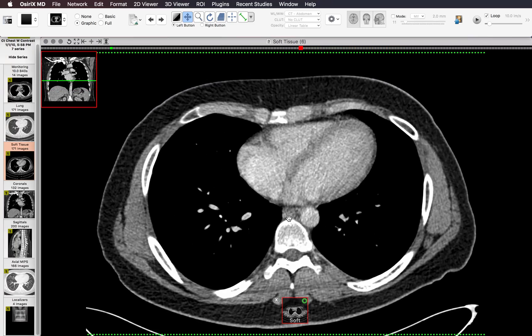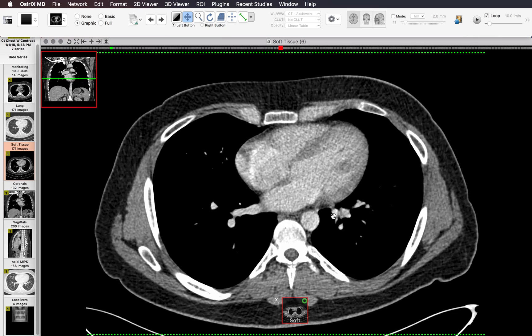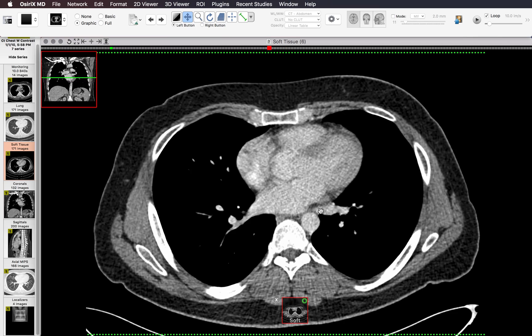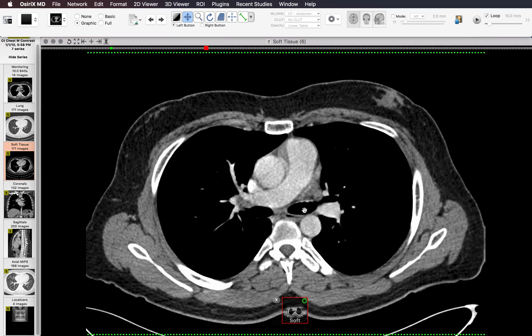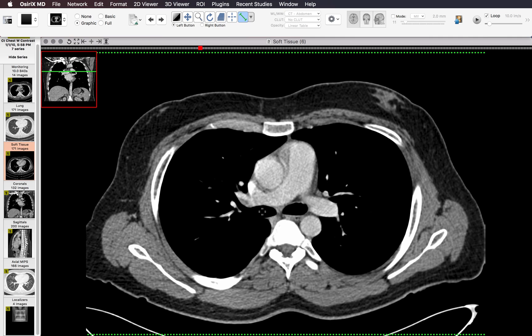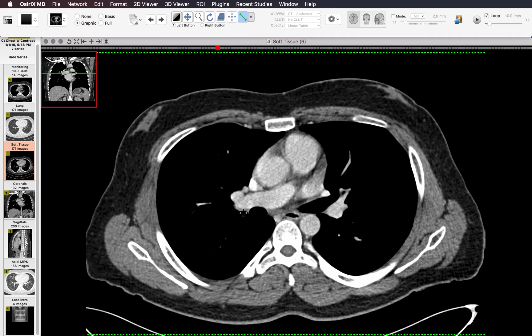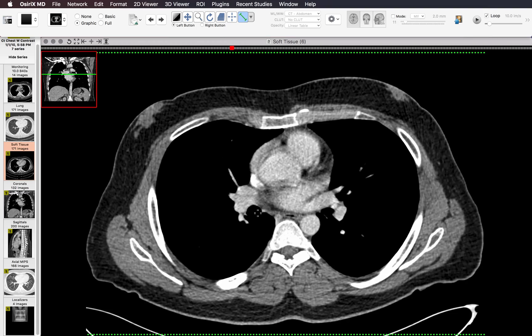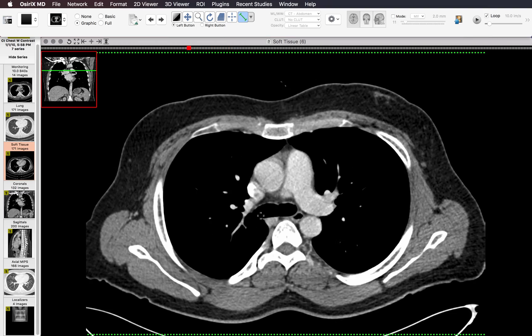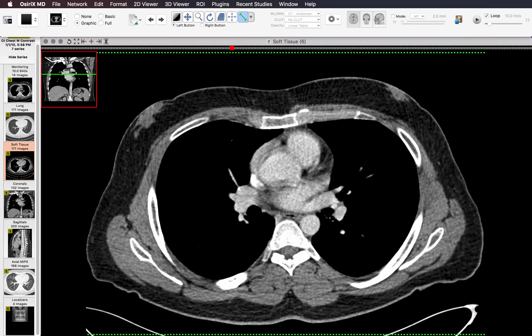This is the azygous vein right here. I scroll up until I reach the subcarinal region. This is what a normal subcarinal lymph node looks like. I then look at each hilum, following each bronchus out and making sure that there are no enlarged lymph nodes in either the right hilum or the left hilum.